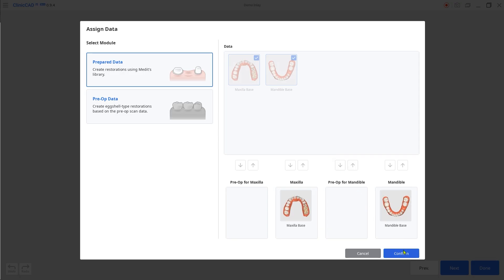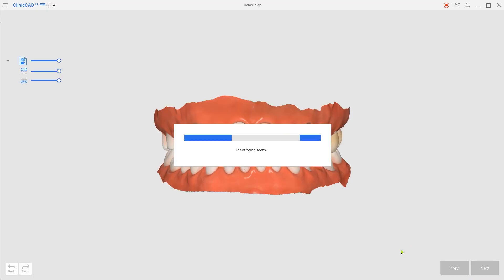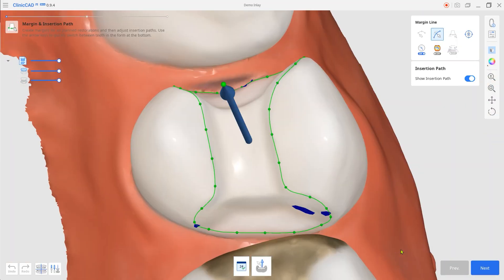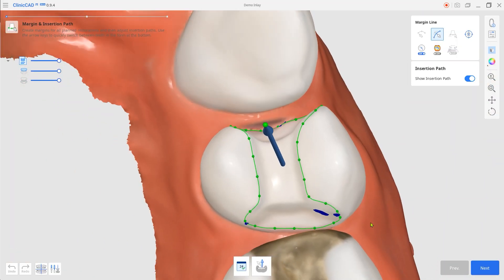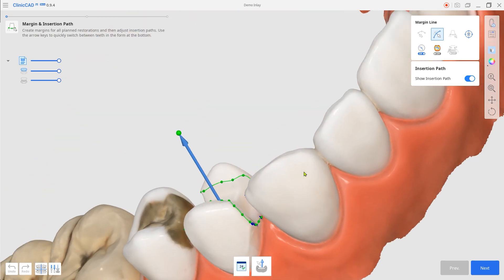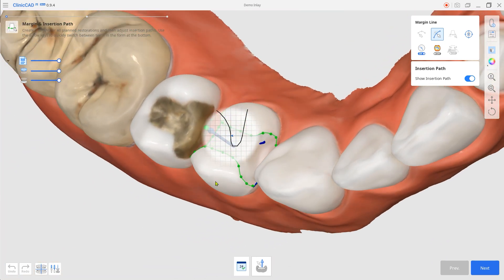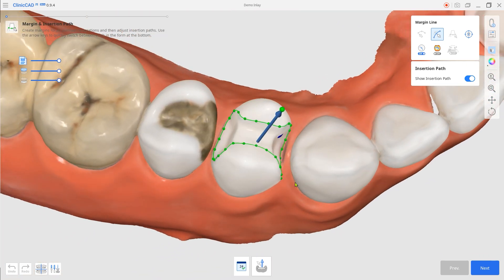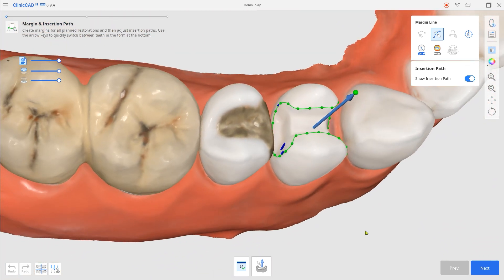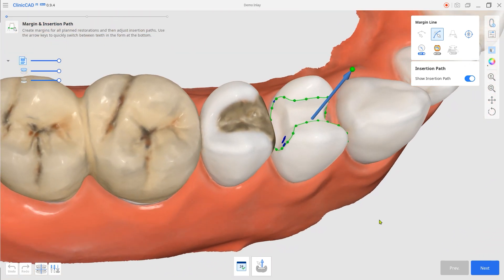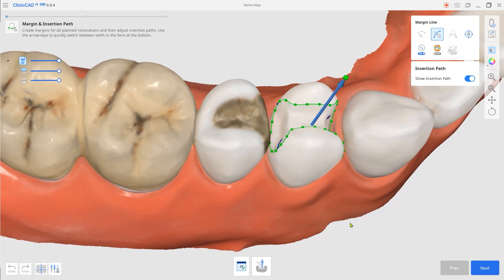We've implemented automatic margin line detection for inlays. This feature is no longer limited to crown cases, and you can now easily set margin lines for inlays.